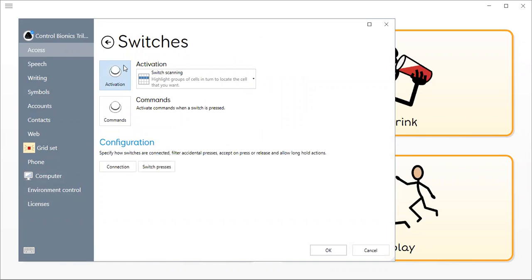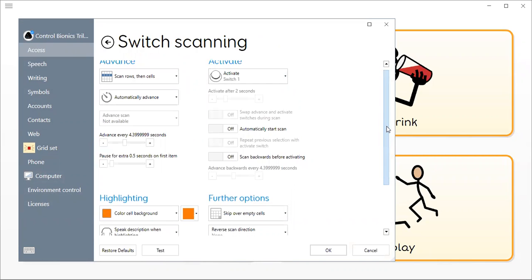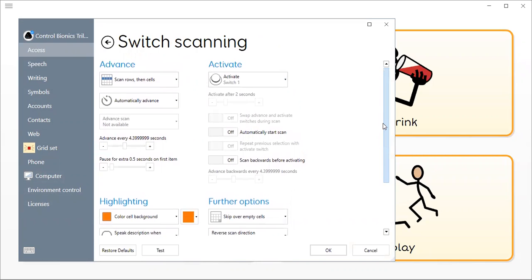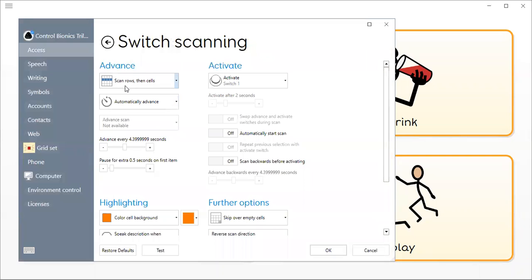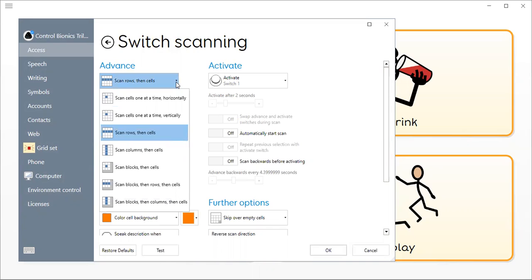Now I'm going to check my activation. In the activation area, there are several things I can check. I can check how it's going to advance, whether it's Scan Row then Cell, or I could choose one of the other options.